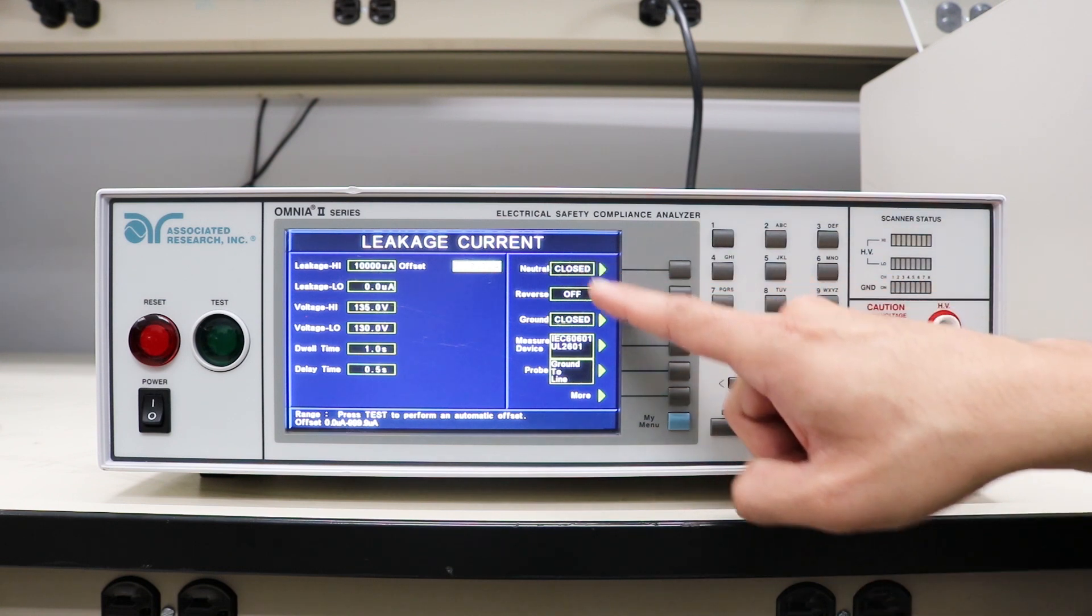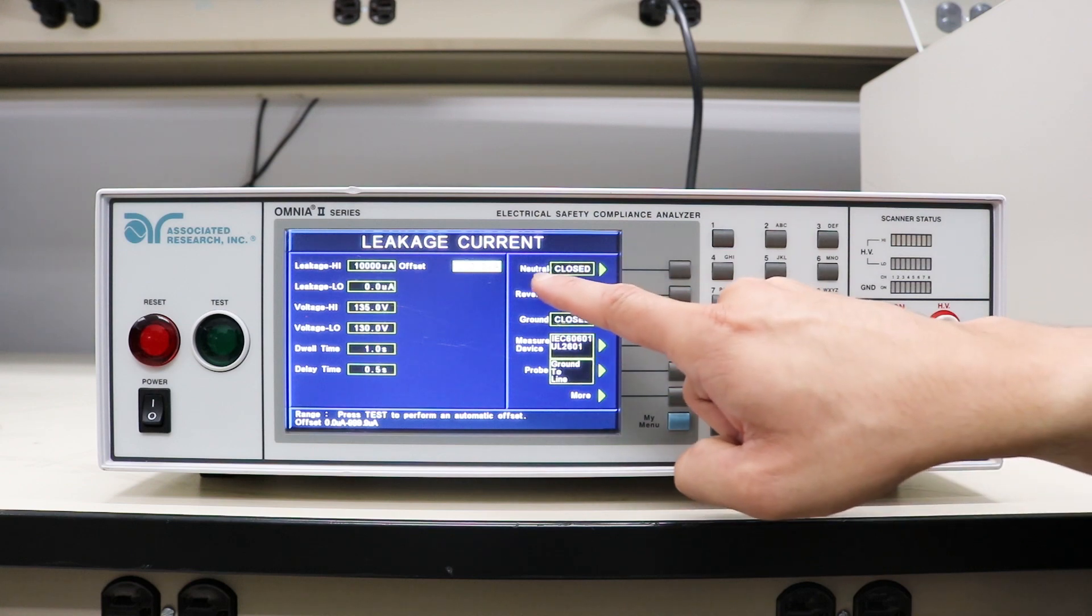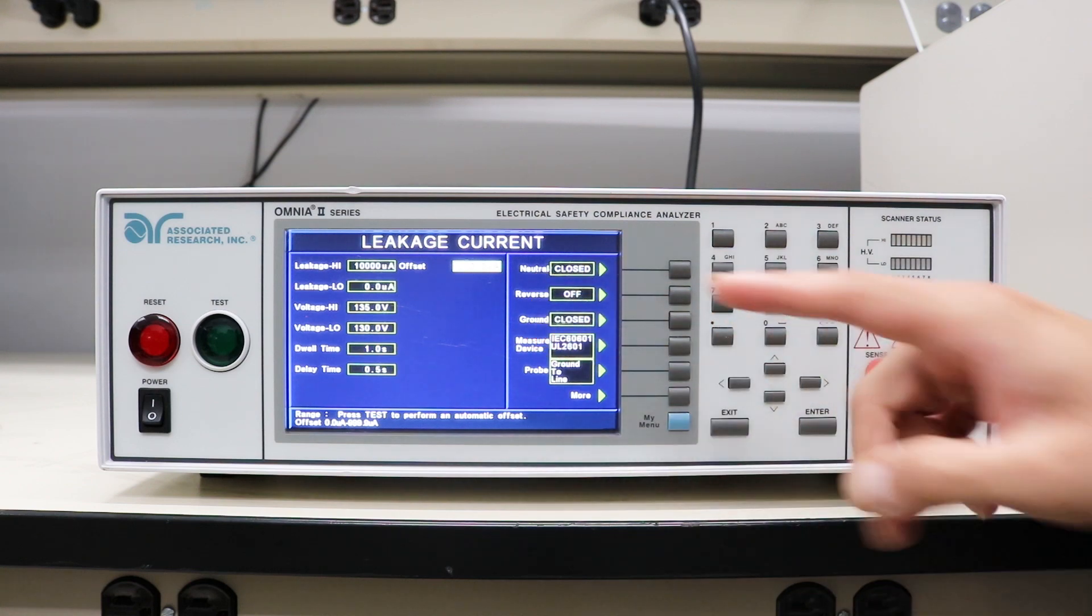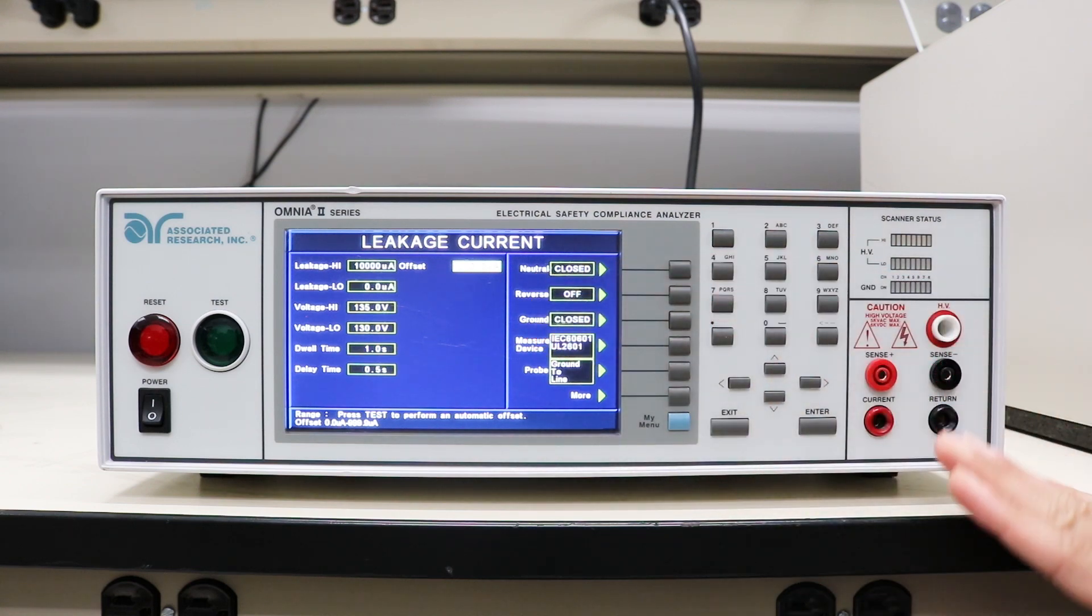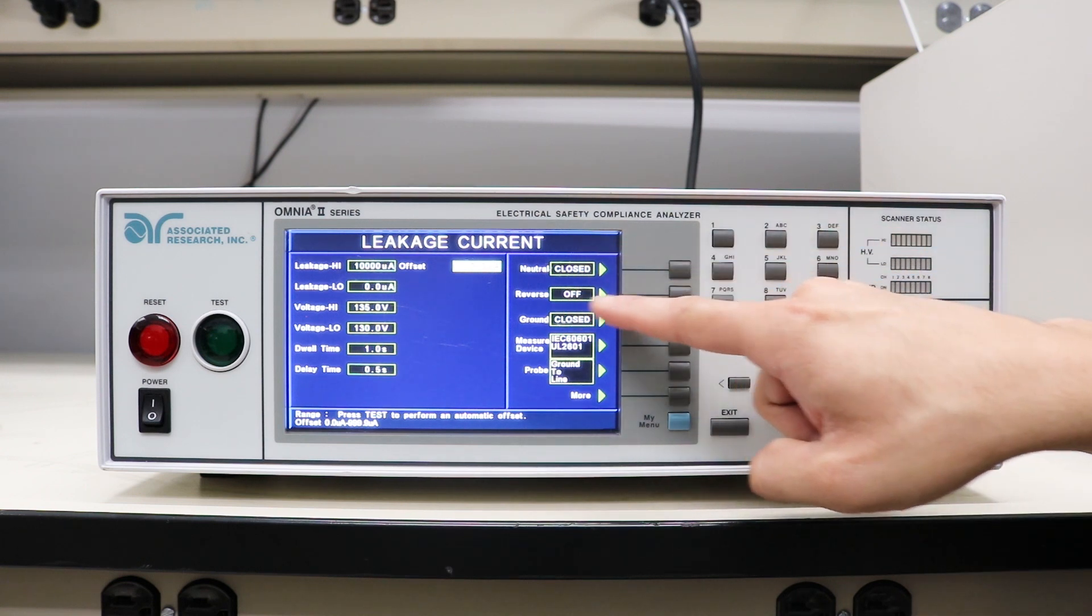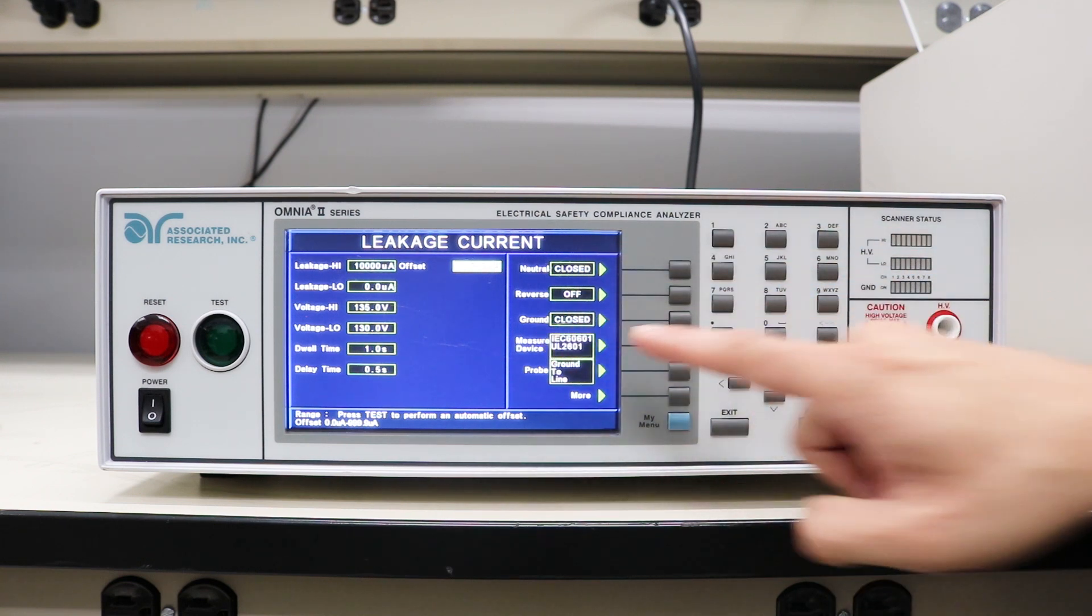On the right side of the screen are the three fault conditions: neutral, reverse, and ground. In the first test step we're going to leave everything as normal. So neutral is closed, reverse polarity is off, ground is closed.